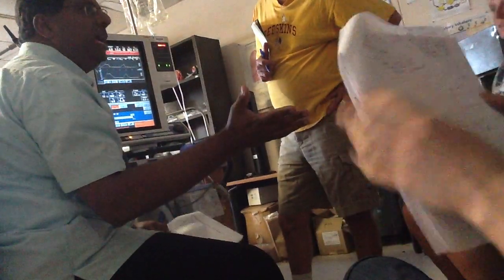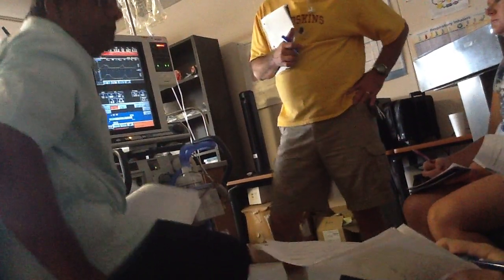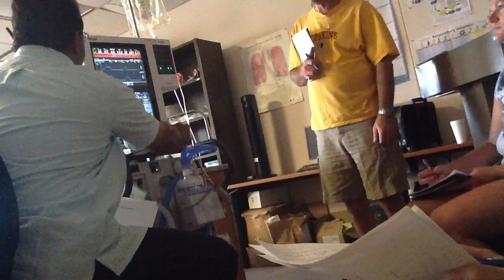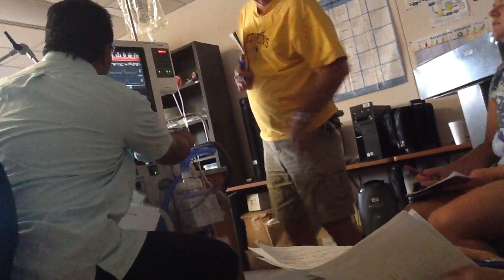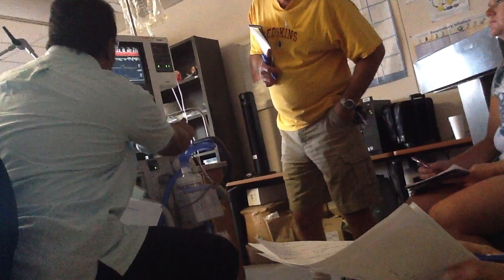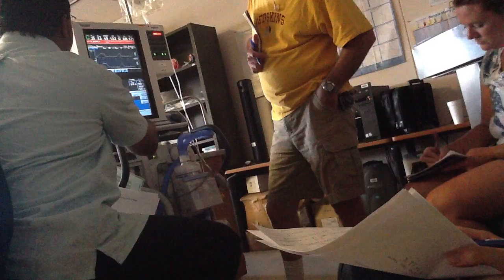On the paper it is 28. But if this is the patient, plateau will be 23 and PEEP 5. Minus it and get your answer. On this particular one, we would want it to be 18. 28, sorry. 28 on paper. Everybody following me? On this patient, the machine is telling me if I go higher than 23, it's not letting you go based on your peak. So you just have to push accept, then keep moving.